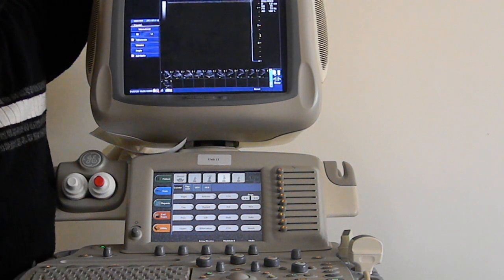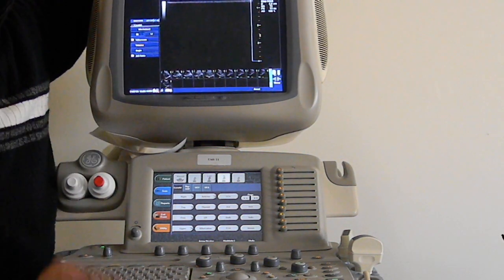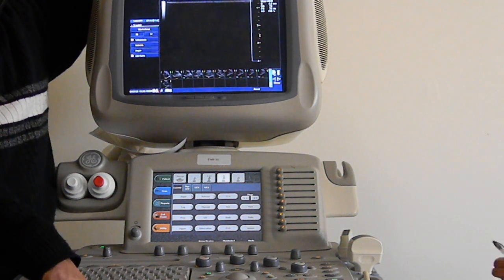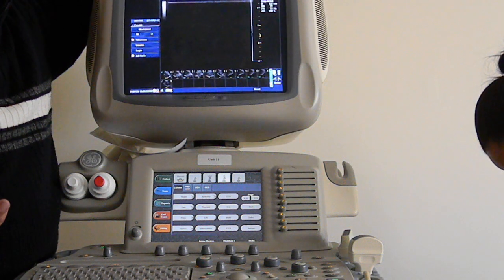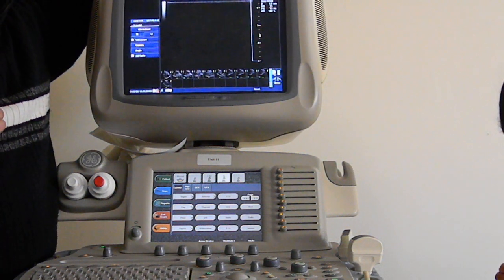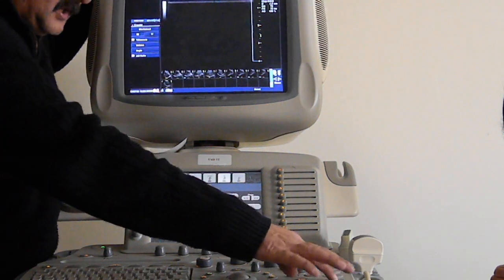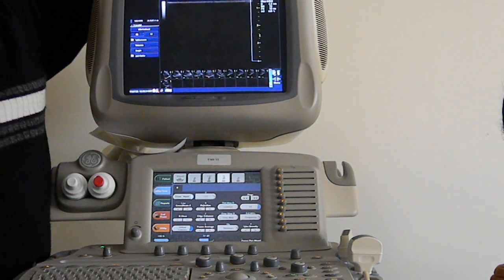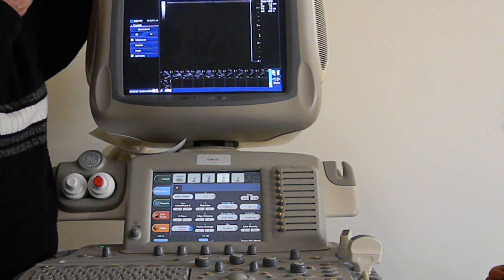What's the gain of coming in today? Knowledge, that you get to see this. So hopefully when you drive home in your car later, you hopefully feel you gained something, especially regarding the knobs of the machine. There's something that you didn't know before. Now you know it. So that's the gain that you got.